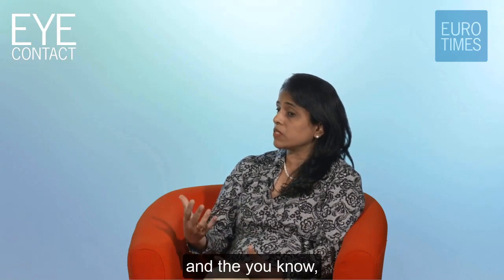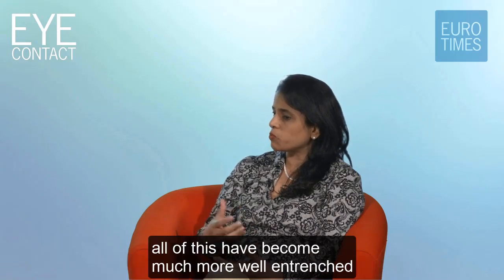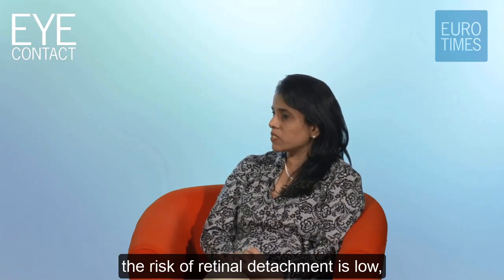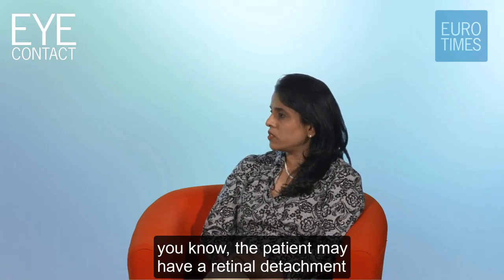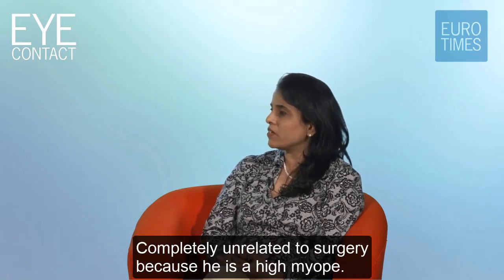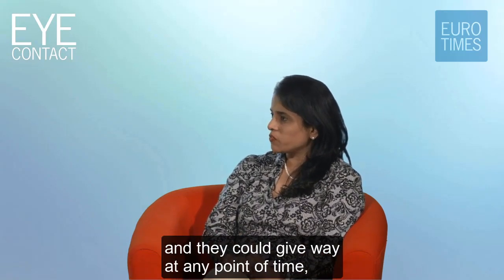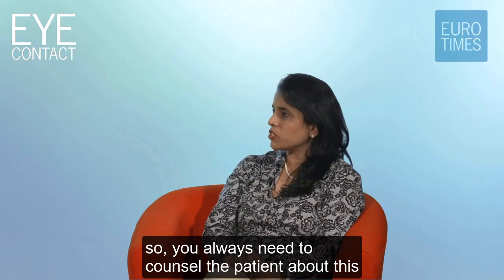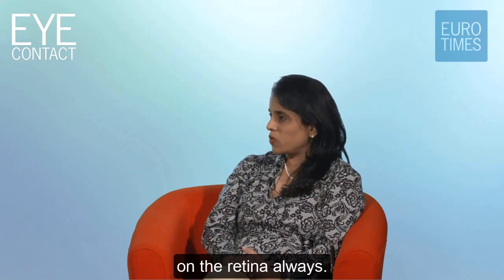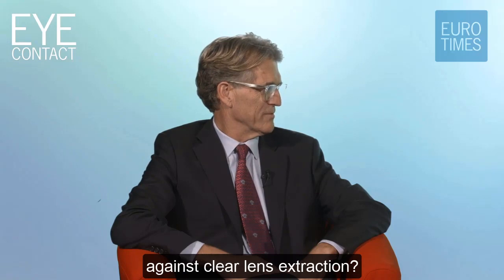All of this, and the need to do a laser before surgery, have become much more well entrenched in the minds of surgeons. So definitely, if you do a good job, the risk of retinal detachment is low, but you can never be absolutely sure because the patient may have a retinal detachment related to surgery, or sometimes completely unrelated to surgery, because he is a high myope, he has weak spots on the retina, and they could give way at any point of time. So you always need to counsel the patient about this possibility, and also always keep a very close look on the retina. Considering the risks, would this be an argument against clear lens extraction?